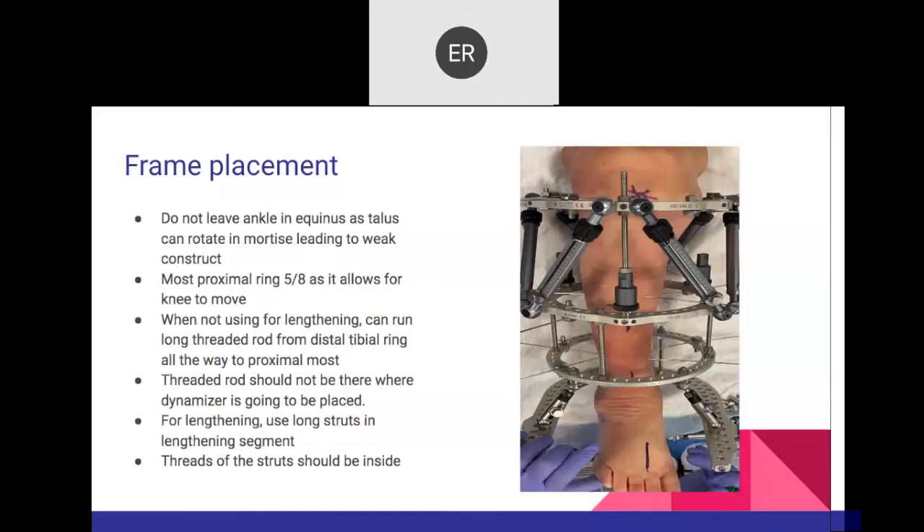The dynamizer component on the ring is used once you obtain the desired length — the lengthening struts are removed, and the dynamizers encourage bone remodeling and formation. You have one dynamizer, then one on the middle side and one on the lateral side, all connected with a threaded rod, and then the struts are removed. The foot wires — two at 60 degrees on the calcaneus and two wires on the midfoot — are also part of the construct.